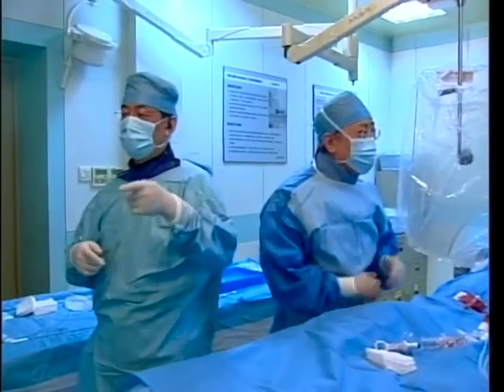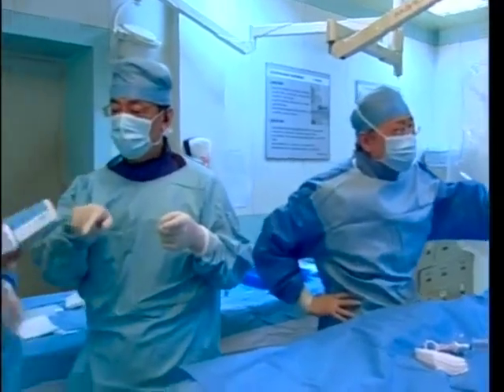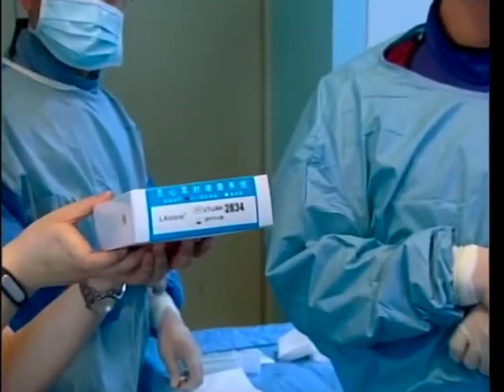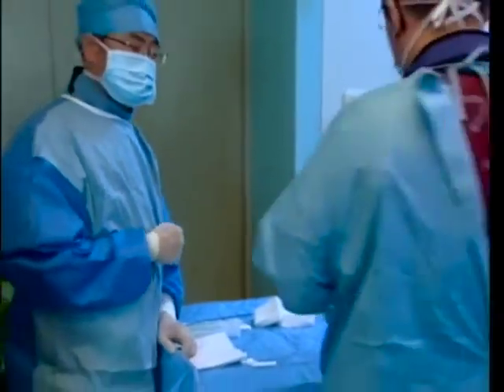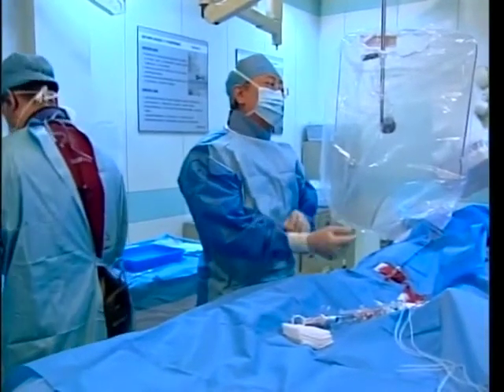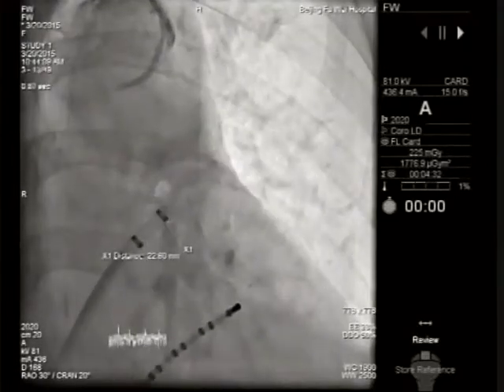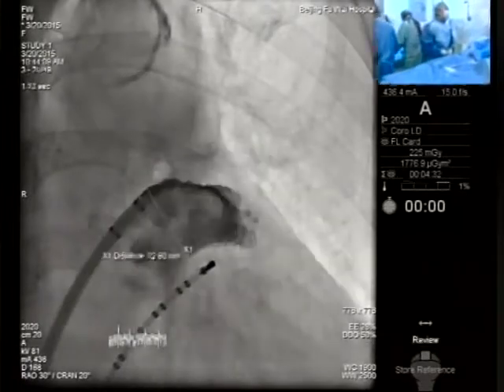Can you show us on the screen where you measured? Just at the orifice, we only measured the orifice. And behind the orifice, there seems to be enough space. You had an angiogram looping a minute ago that showed the measurement. Yeah, here we go. Do you see the measurement? But that's 22.6, right? Yes.